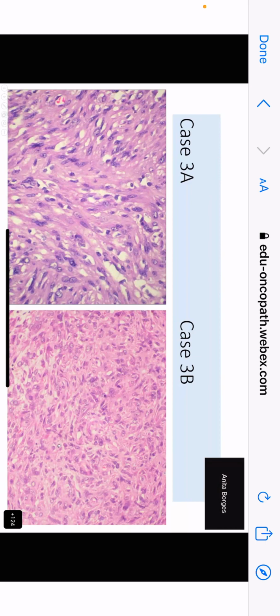These are spindle, or when the fascicle is cut at right angles, they're round. But what are these nuclei? Apart from being spindle, some of them show marked pleomorphism. Some of them are triangular, almost, or irregular, which suggests that their cytoplasm cannot be spindle, right? Cytoplasm is probably stellate. It's not all over. There are some stellate cells. Many of them are spindle, but there is some degree of stellateness to the shape of these cells. So this is at high power.